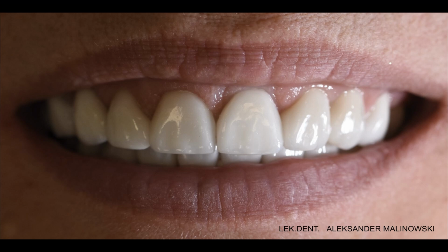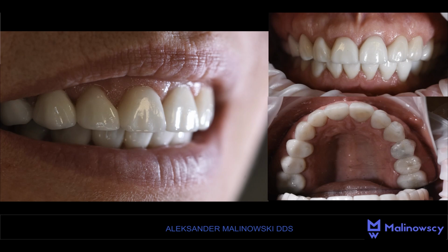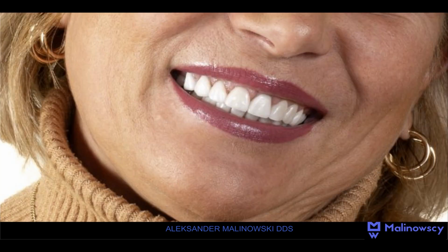The patient has stopped complaining of headaches and also reports the disappearance of symptoms such as nocturnal grinding. The condition of the gums is very good and the aesthetic effects also seem good. Here you can see the photos and the smile. So let's go to another case.